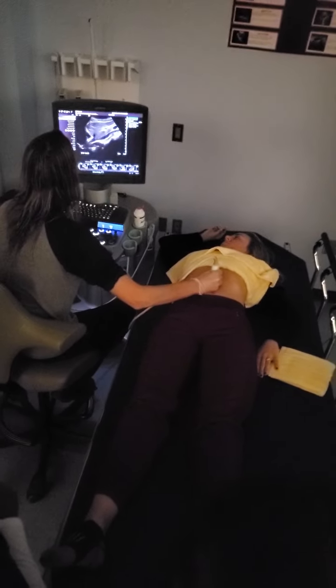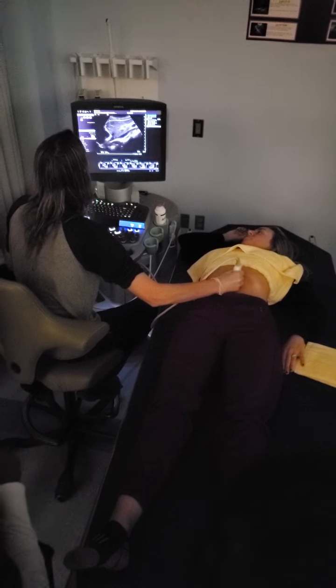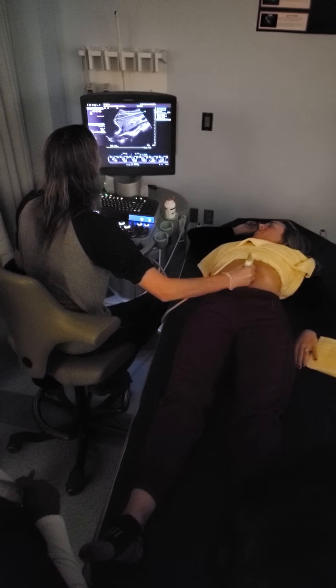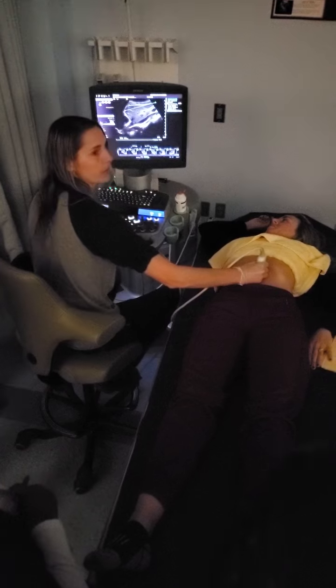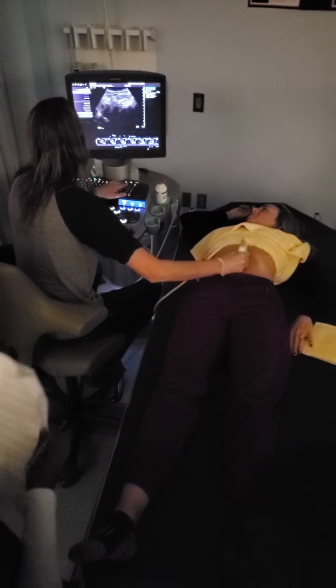But we're going to do just an actual superior to inferior in this case. So inside that diaphragm to that inferior margin. Shea, you're measuring off the screen. Yes, well, our machines are stupid, so that's how it goes. But out in the real world, we have some tools for that. Okay, so now we're ready for transverse right lower lobe.